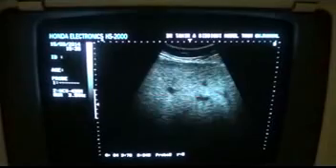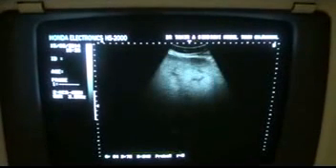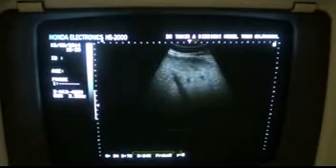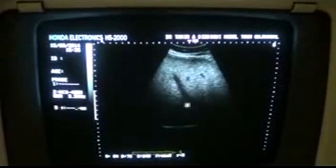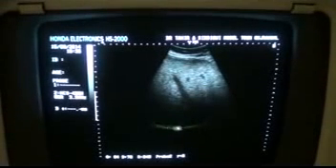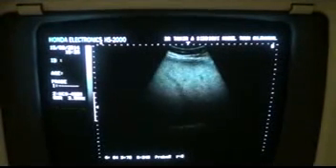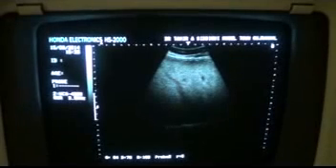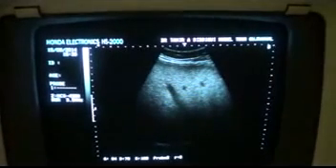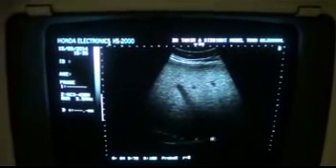And the second thing to see in fatty liver, depending upon the degree of fattiness of the liver, you will see that the diaphragm, this is the right hemidiaphragm, will appear thin. It's appearing thin, papery thin rather. So this is the second point of understanding why the diaphragm is appearing papery thin.